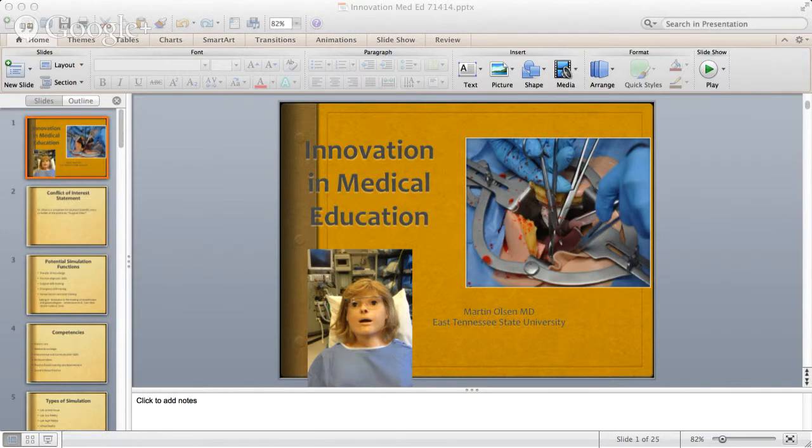And the purpose of this simulator is multifold. So number one, we can teach people just how to operate. She has a blood supply. It's a physiologic blood supply. And that means that if the teacher wants the blood pressure to be 60/0 and a patient in shock, then that's what it is, and the pulse is 140. Or if they want the simulator to have a blood pressure of 120/80 with a pulse of 70, that's what she has. And so the learners have a chance to operate in a controlled environment.